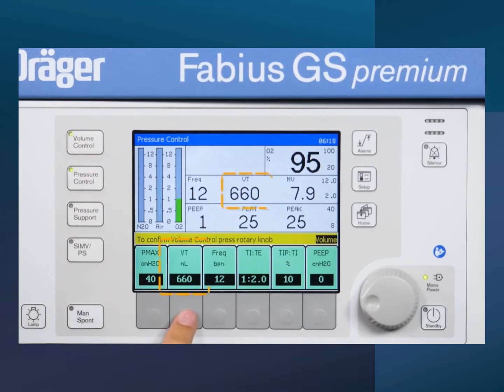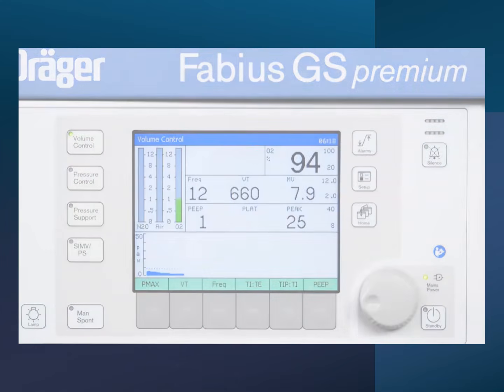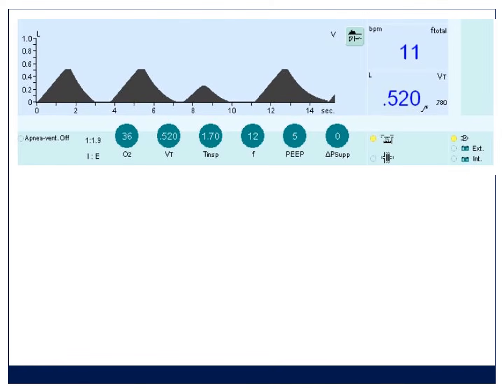If you press volume control, you see it's suggesting that 660 should be the tidal volume, and then confirms, and then that's what's delivered. So these ventilators are very intuitive. They actually work out what the numbers will be if you change modes. So they'll often give you suggestions when you're changing across like that. And those things you can practice, like I said, with a test lung.